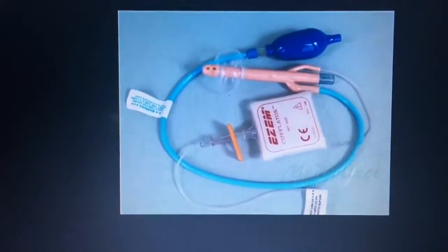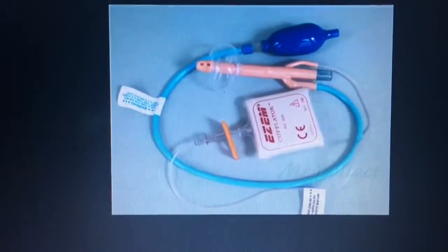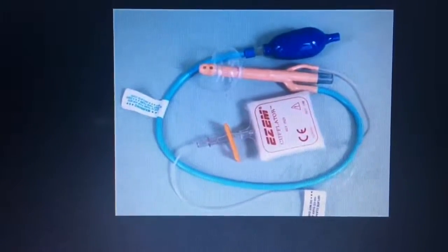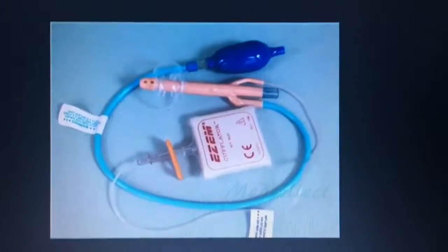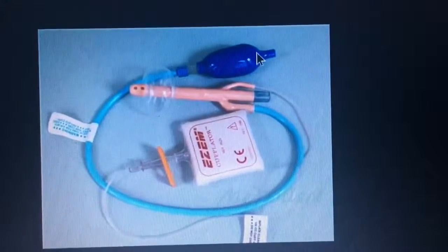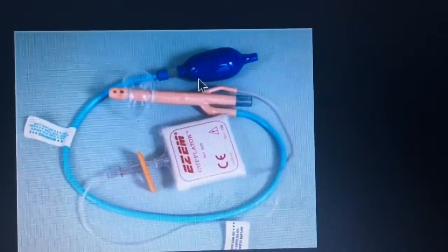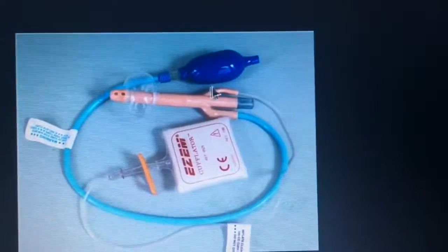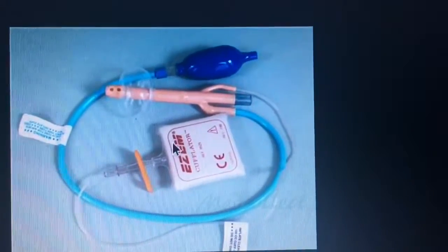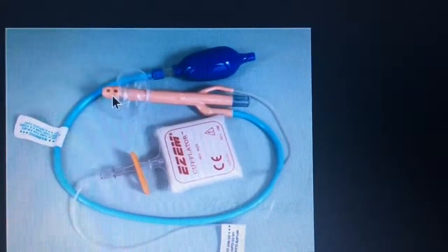We had the patient change into a gown and removed any metal from the body. Let's go real quick over the supplies used in the barium enema. First, this would be the bulb to inflate the air through one of the lumens. This is a double lumen barium enema tip. This is used for double contrast. This other little hose goes to the cuff inflator, this little balloon thing. This here is the actual barium enema tip.